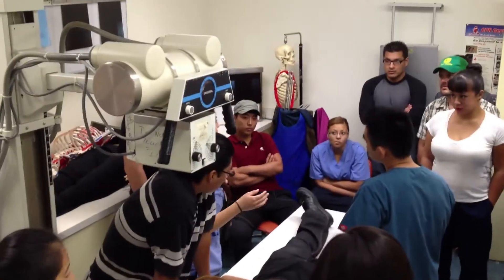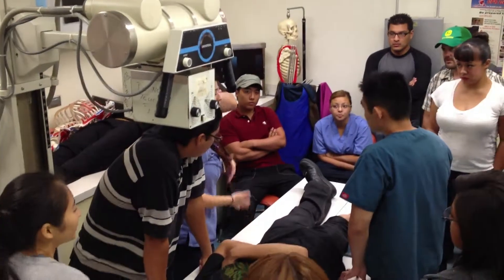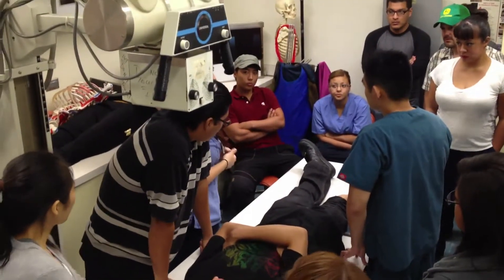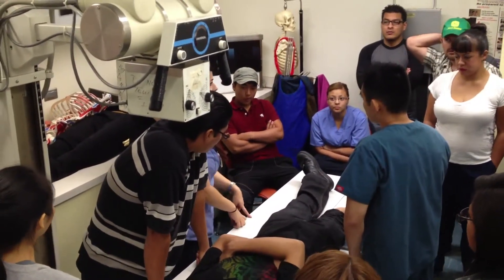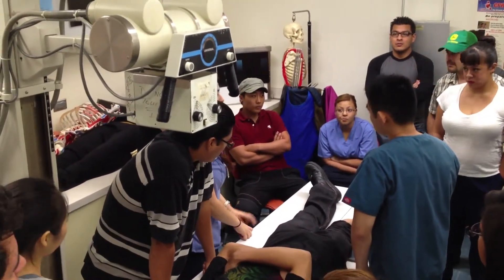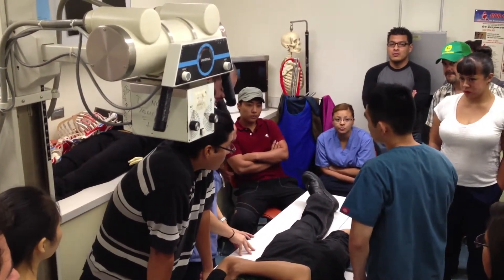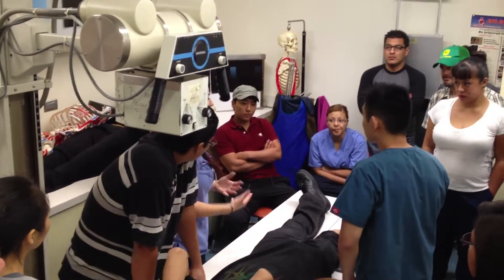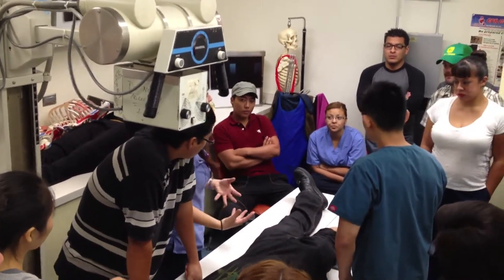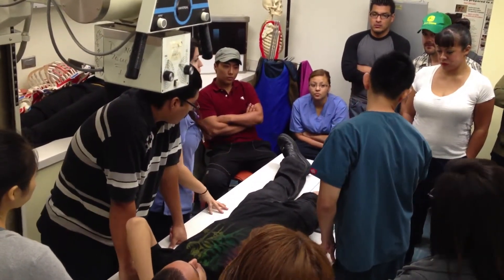It says anything more than 10 centimeters requires Bucky. It honestly depends on your department. Most departments we've been to want these done with the Bucky — I think the technique looks better. It's just more mass. As you put the grid on or go with Bucky, you need to add a little bit more technique to it. But it gives you a better image. I would get used to using the Bucky.